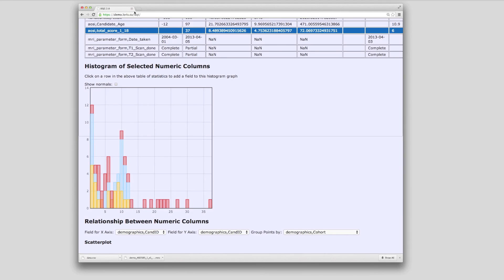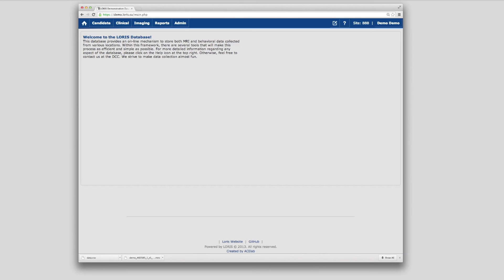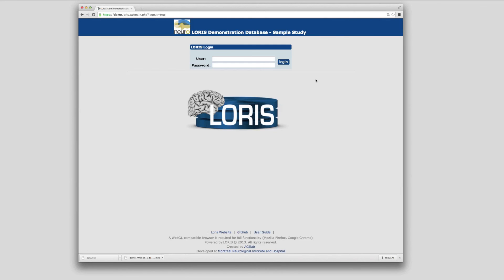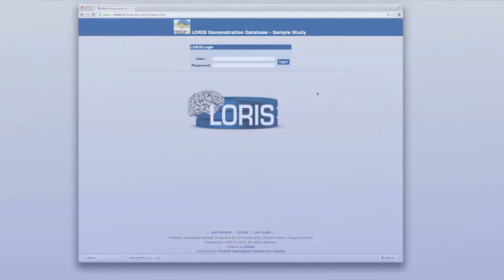This concludes our introductory video about LORUS, briefly covering its basic capabilities for data storage, quality control, dissemination, and project management. For more information on the many features of LORUS not covered in this video, how LORUS works, and how to get LORUS, please visit our website at www.loris.ca.